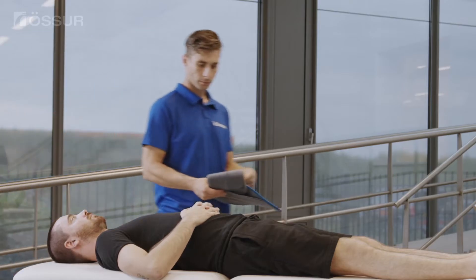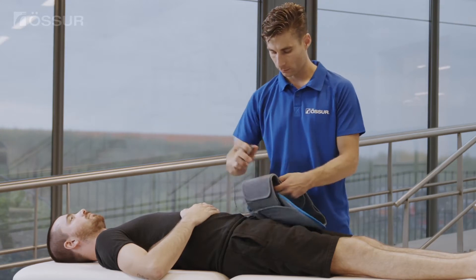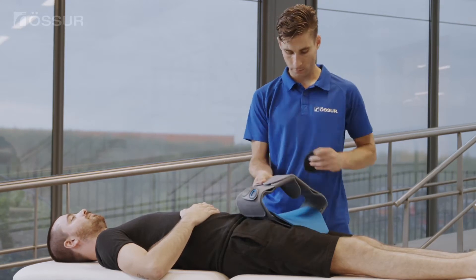If a fit tool is not available, fold each belt arm equally to achieve the desired waist circumference and secure the belt ends.